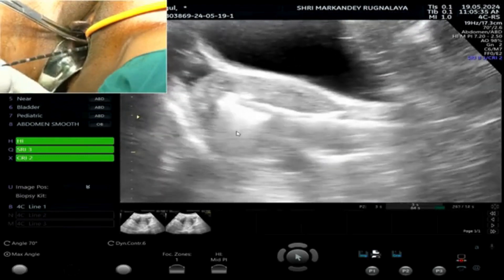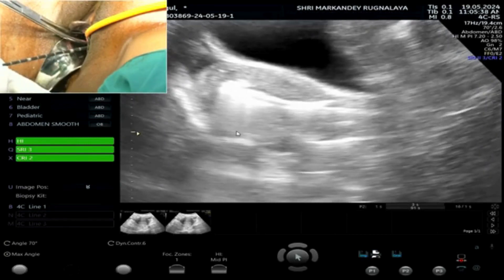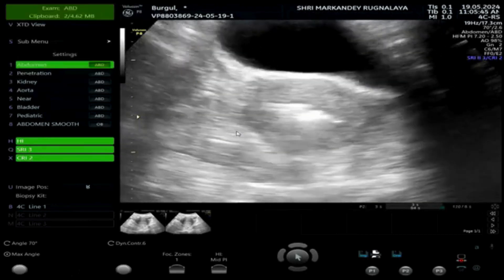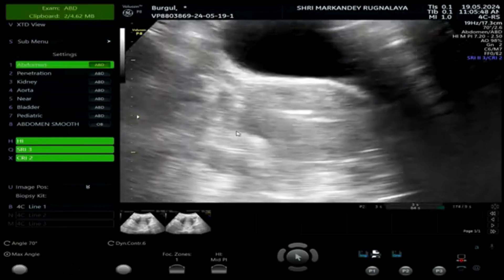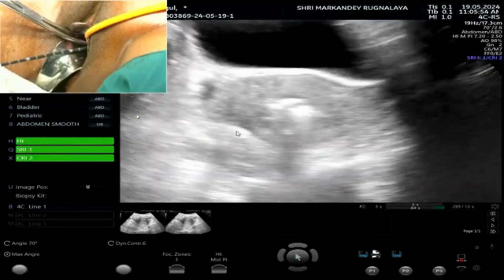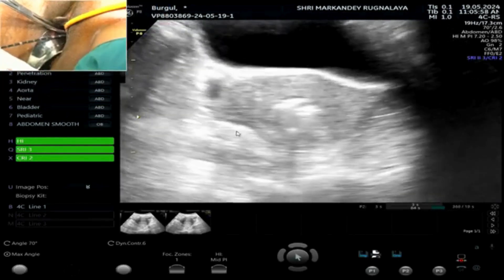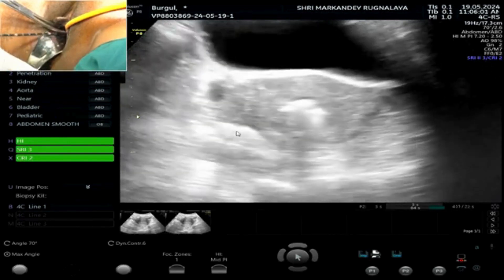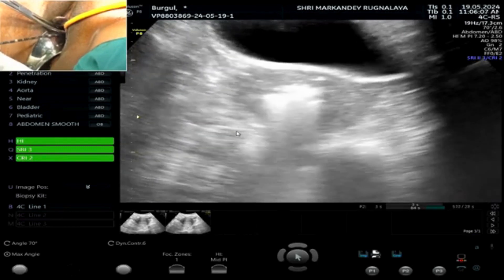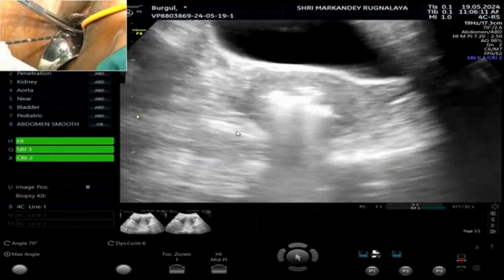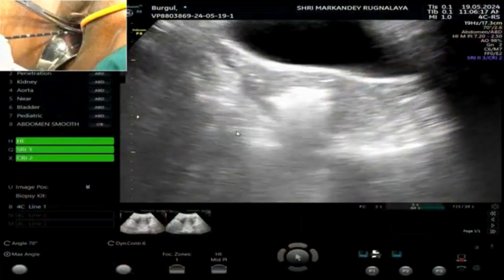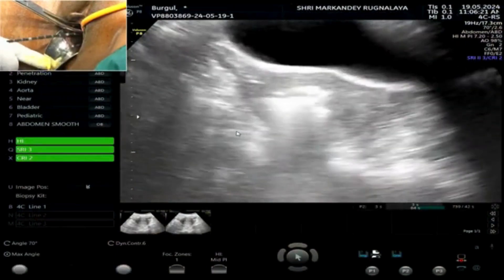I am moving along the anterior wall of the fundus. Can you change to the transverse direction? Once ablated, ultrasound cannot — the rays cannot pass. The firing is going on. Wide gasification under only the myometrium. Sometimes you will get a blasting sound also — simple sounds because of bubbling.